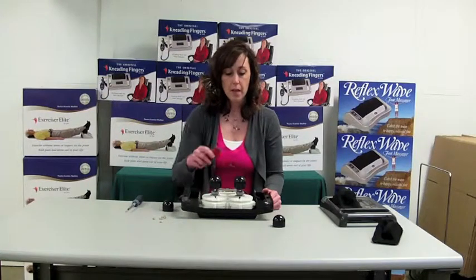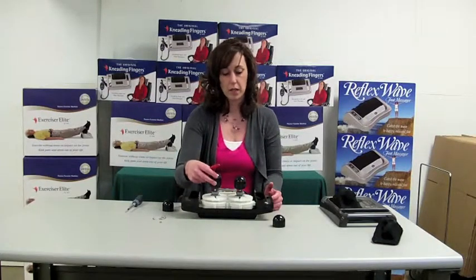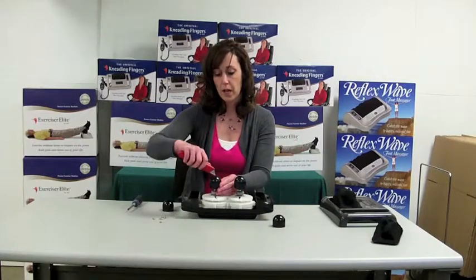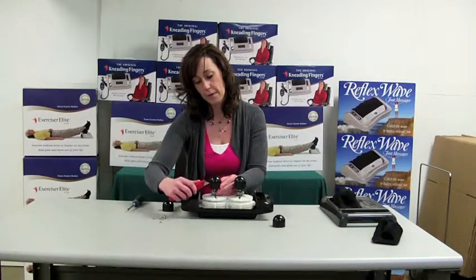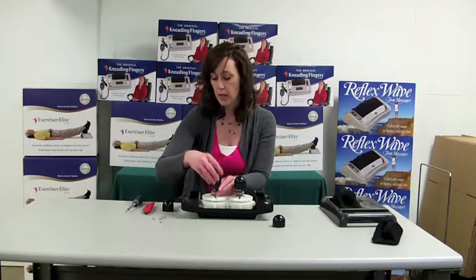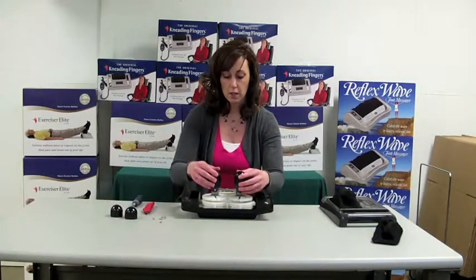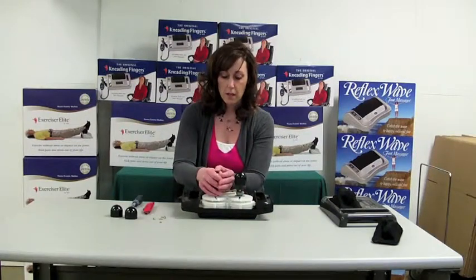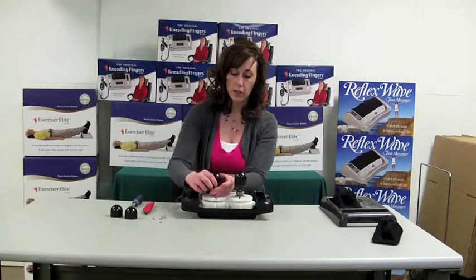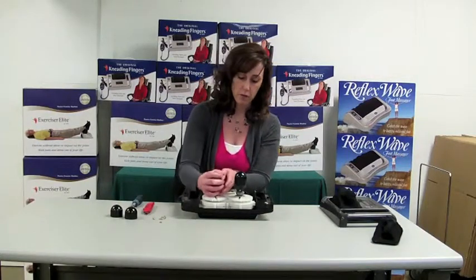We'll take our utility knife — if your knobs don't lift off easily, take your utility knife and cut a slit down your cap, then peel that cap off. These are coming off nice and easy, so we'll just lift those off. Then your new ones, just slide those on. They will go on a little bit harder because they are new. There is a hole in the top of the cap to let air out, so make sure you don't cover that when you push them on.